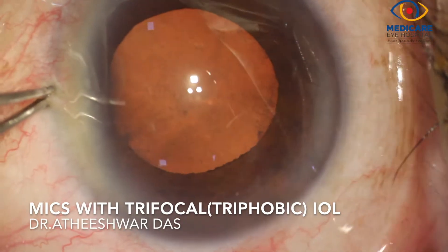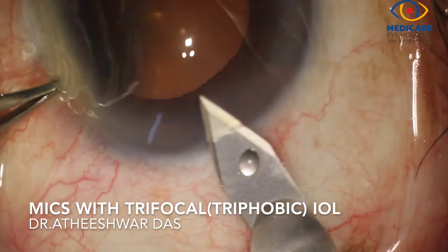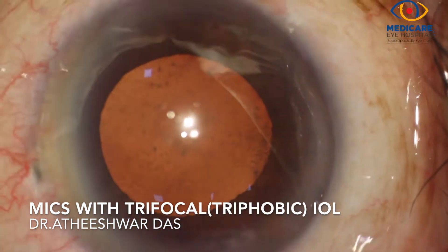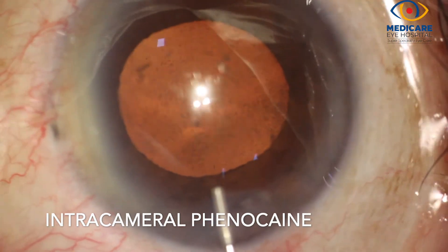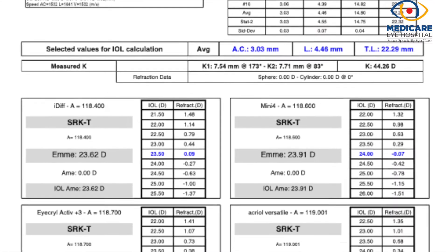This is a video of microincision cataract surgery with Indian trifocal intraocular lens implantation in a 64-year-old male patient with a soft cataract, nucleus sclerosis grade 1 to 2. We begin with a 2.2mm temporal clear corneal tunnel incision followed by intracameral injection of phenocaine, which dilates the pupil and gives anesthesia.